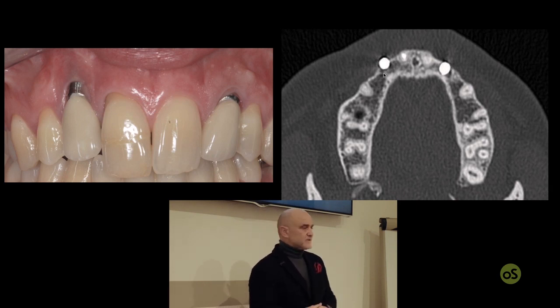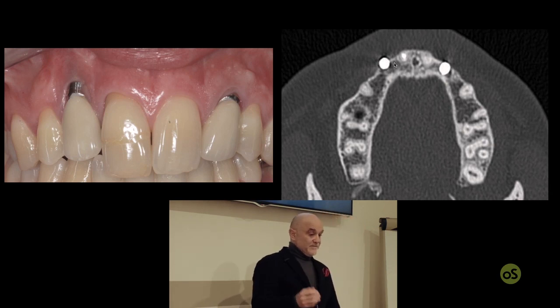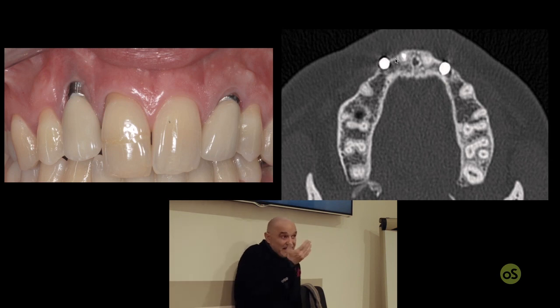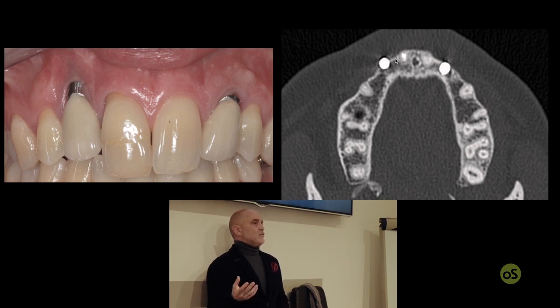I have to tell you, not so much. So, in my opinion, even if there is a lot of implant that, due to bad implant placement, doesn't have any buccal bone, this is per se not an indication or a reason good enough to extract the implant.